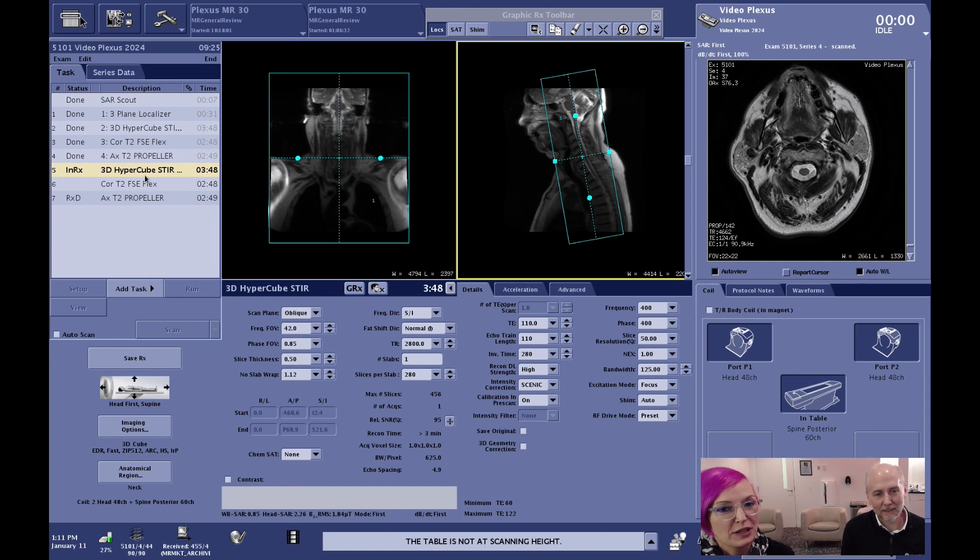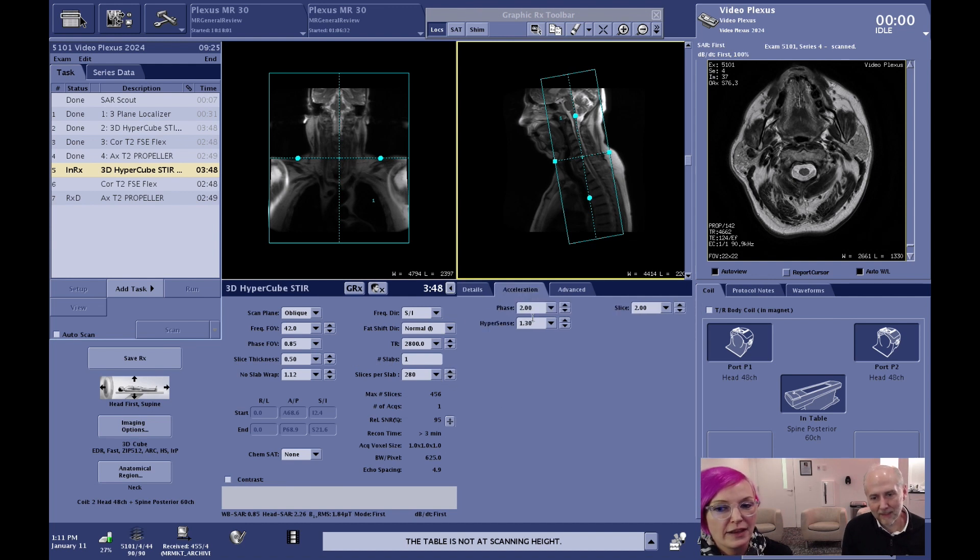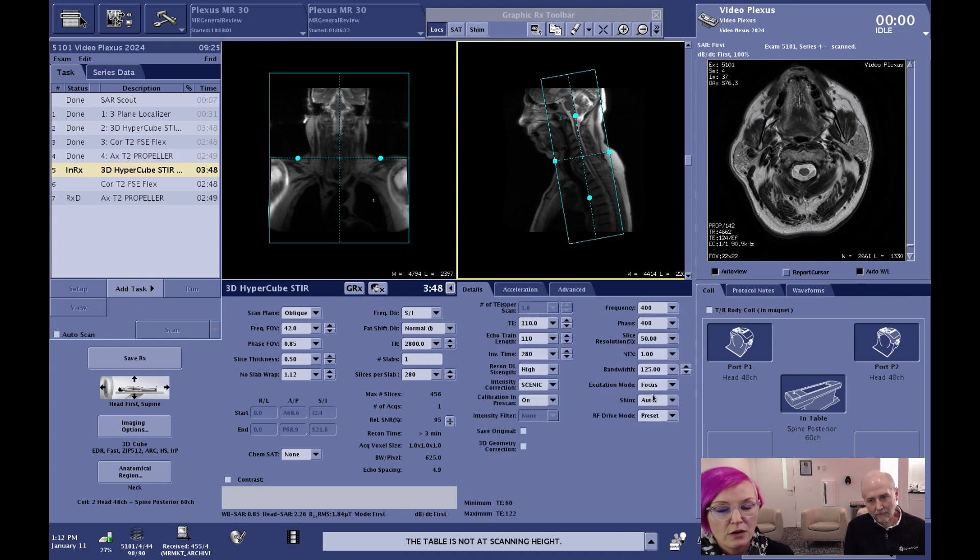We started with the 3D Cube, which we did in a STIR contrast. As a reminder, when we pull up the sequence here, we can see we activated and used HyperSense. To activate HyperSense, you just go to the acceleration tab and you can see the factor. On top of that, we used something called HyperCube — we set the excitation mode to Focus, which allows us to reduce our phase field of view, reduce scan time, and bring it down to 3 minutes 48 seconds.